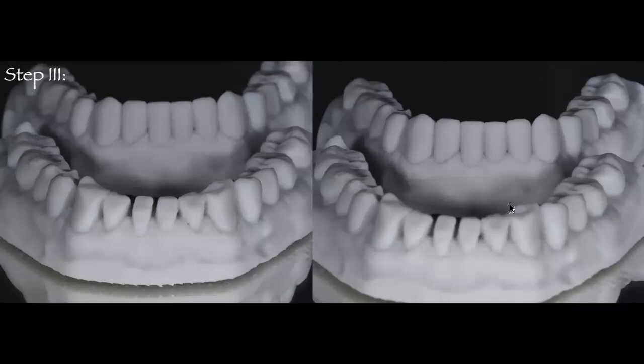And that's what you're seeing here. What you're seeing here is a 3D printed model. You can see the excessive wear on the photo on the left hand. You can see the excessive wear on the scan and on the 3D printed model on all the mandibular incisors and canines. And what you're seeing on the photo on the right is now a beautiful wax up that also recreated a new canine cusp that would allow this patient to have canine guidance.